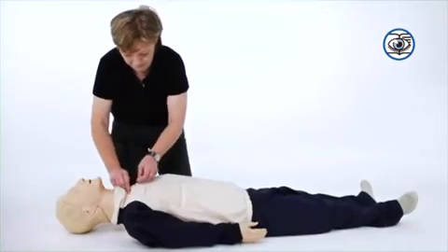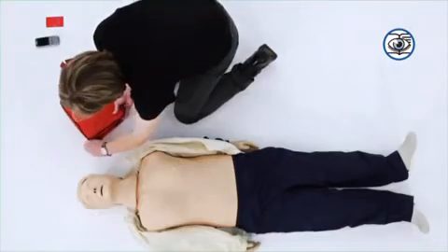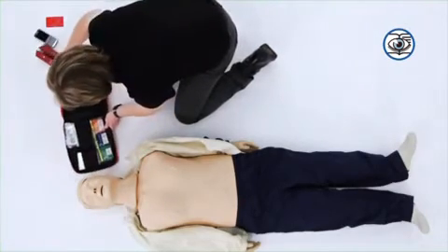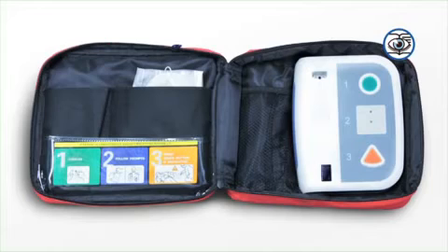So let's watch Ross and Linda work through the use of an AED. Remove clothing from the patient's chest. Some AEDs will automatically switch on when the lid is opened. Other AEDs require an on button to be pressed. Apply pads to patient's bare chest. Plug in pads connector next to flashing light.